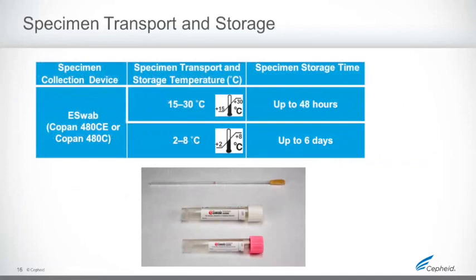Specimen transport and storage. These specimens are stable at 15 to 30 degrees C for up to 48 hours. They are also stable between 2 and 8 degrees C for up to 6 days.